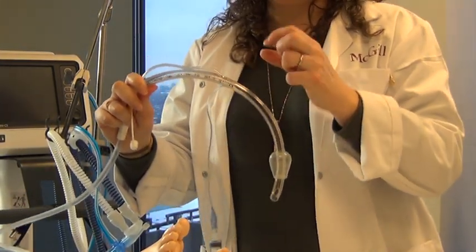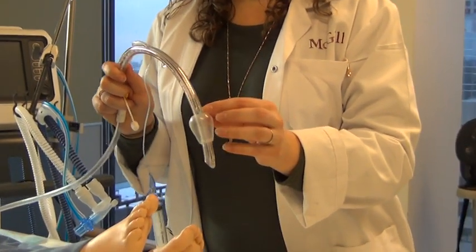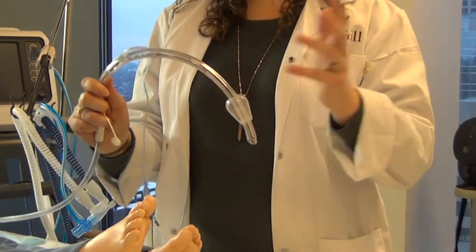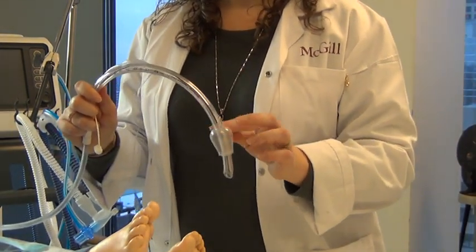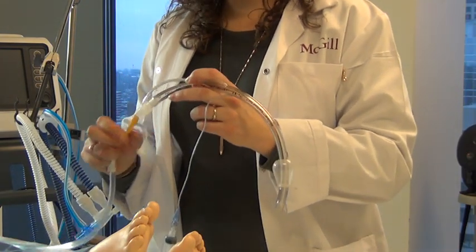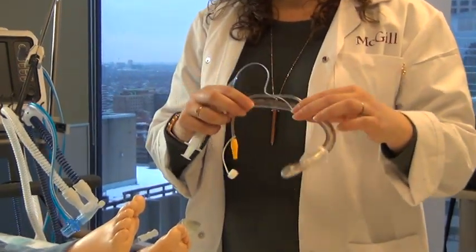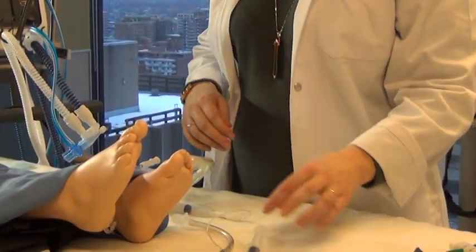As we turn on the suction, there's an opening here just at the top of the cuff that will actually go and suction out all of the secretions. So every 4 hours, for example, you can connect the suction. It will suction out any accumulation that there is above the cuff, and will go directly into our suction canisters. So these tubes may be found in some of the hospitals or in some clinical units.